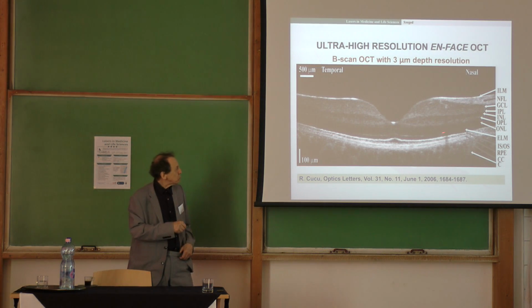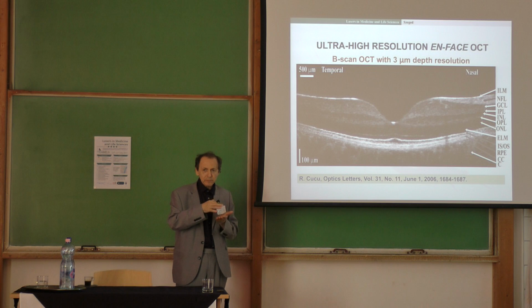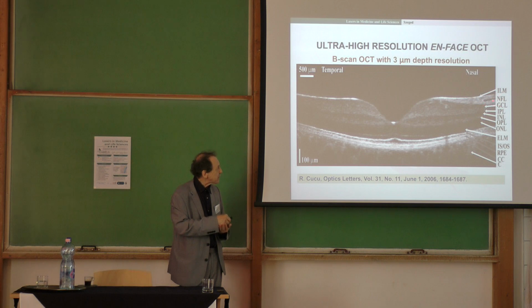People with glaucoma will suffer from this layer. You see this layer here? This is called nerve fiber layer. This is the layer which collects the electrical pulses and sends the pulses towards the brain. So due to pressure in the eye, the vitreous is here, above. The vitreous is here. Okay. So due to pressure in the eye, this nerve fiber layer gets thinner. And that shows the onset of glaucoma. In glaucoma, that's where the sufferance takes place, in the optic nerve layer. This layer here becomes thinner.